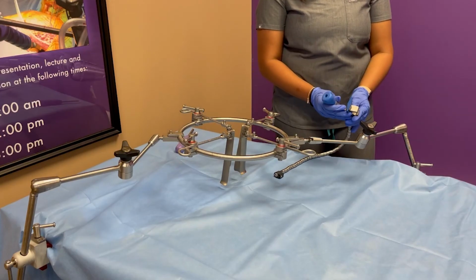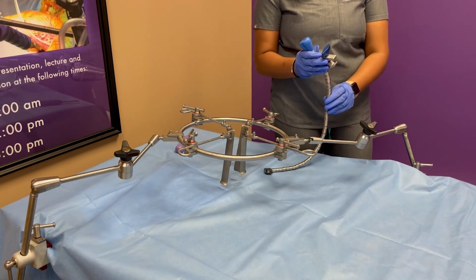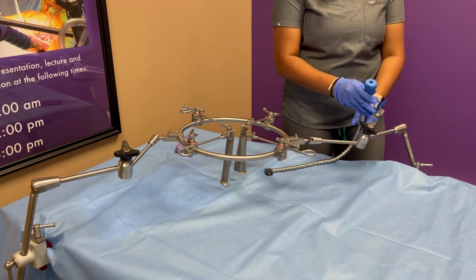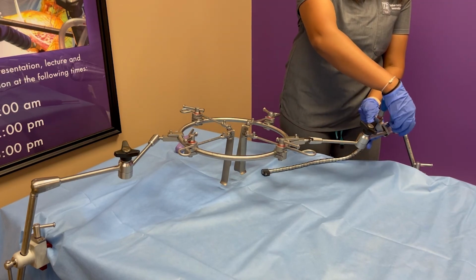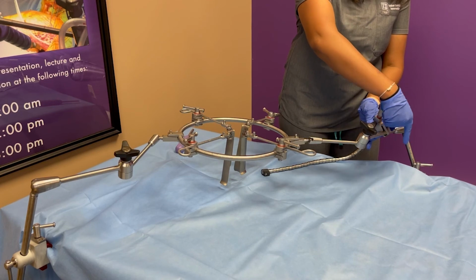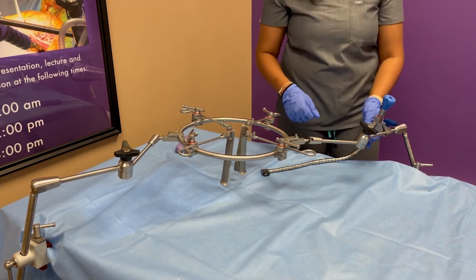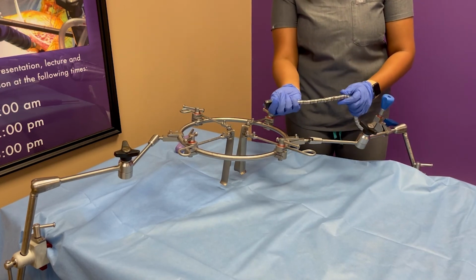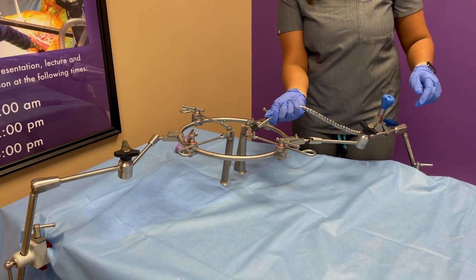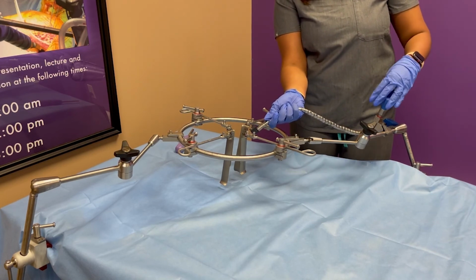As an optional step, if you would like to add direct illumination, you can assemble our light cable flex arm onto one of your articulating arms. Once you have it clamped down on your articulating arm, you can take the flex arm, position it where you would like it directly into the incision, and tighten down using this knob.